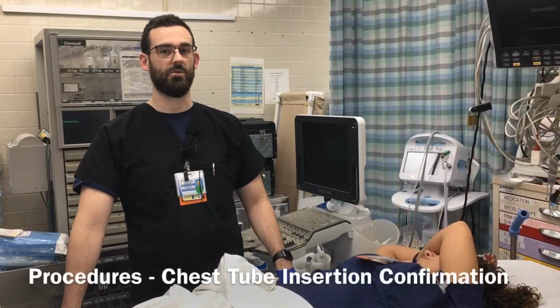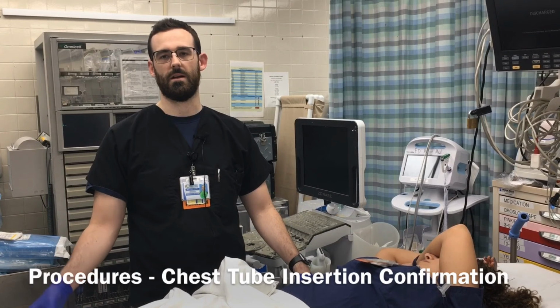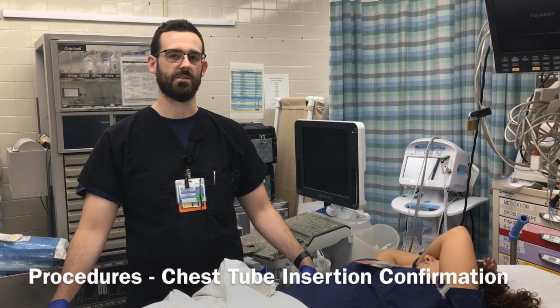One last thing you can use it for: if you do a lung view during the EFAST and you see a pneumothorax, after you place the chest tube, if you don't have an X-ray immediately available, you can redo your lung views and make sure that you get lung sliding back, knowing that your chest tube is in the right place.